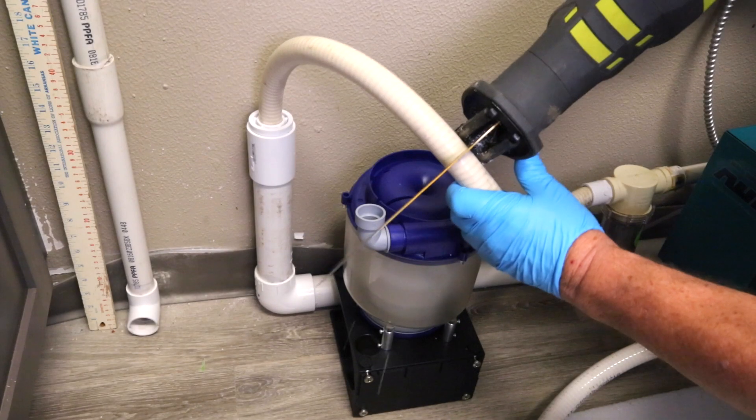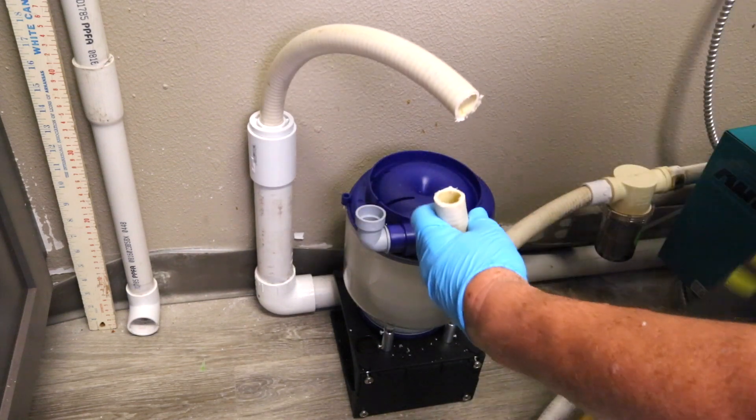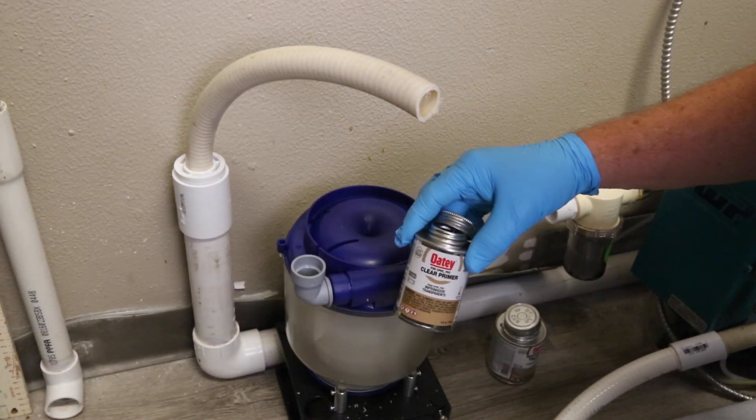The next step in preparing for installation is to cut the surrounding piping. Now that you've cut the piping, it's time to insert the Eco2 separator into the piping system.